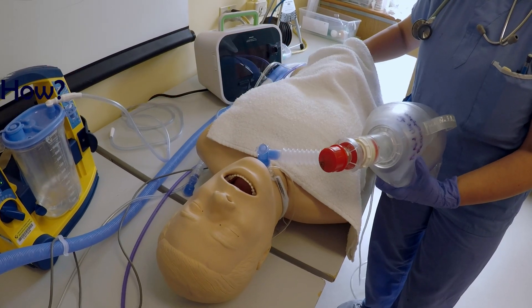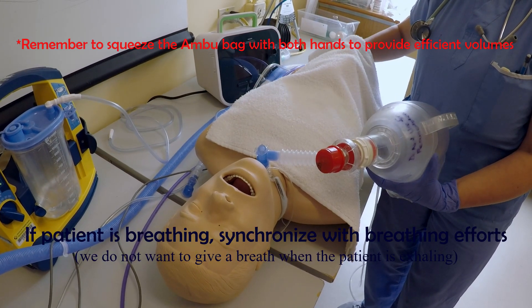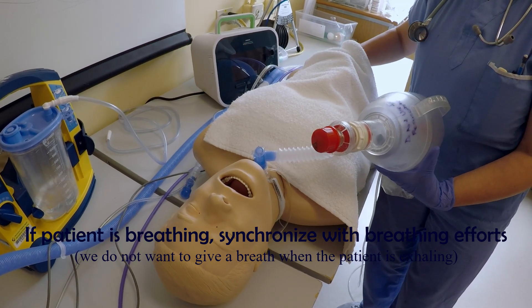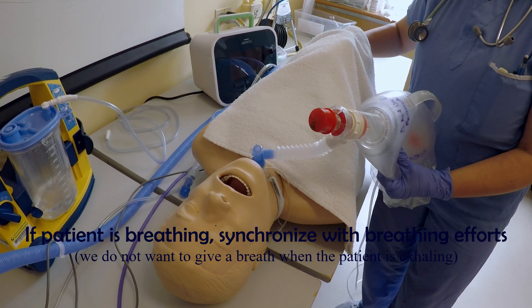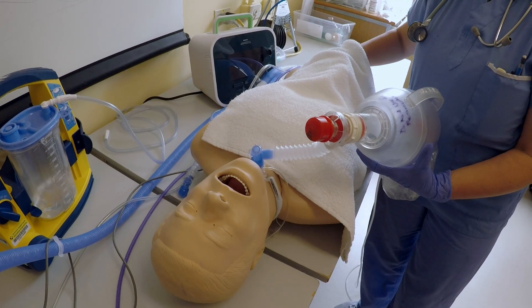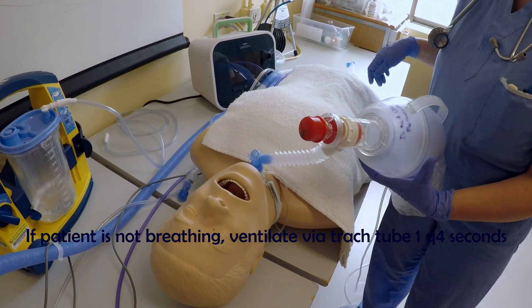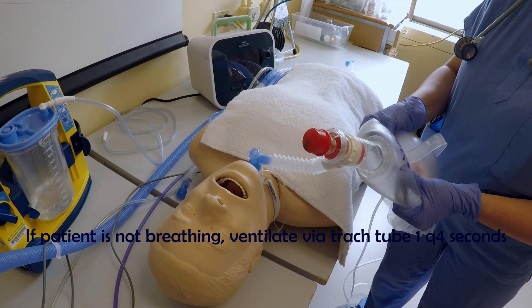How? If the patient is breathing, synchronize with the breathing efforts. We do not want to give a breath when the patient is exhaling. Just follow the breaths initiated by the patient. If the patient is not breathing, ventilate via trach tube once every 4 seconds.